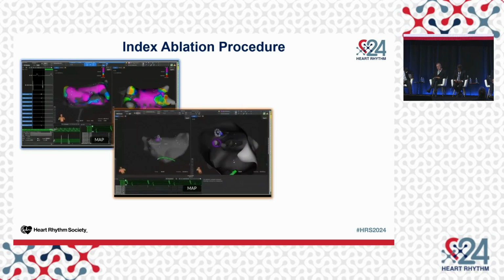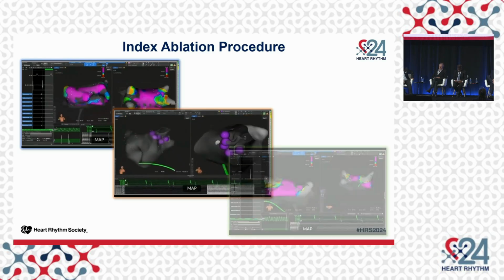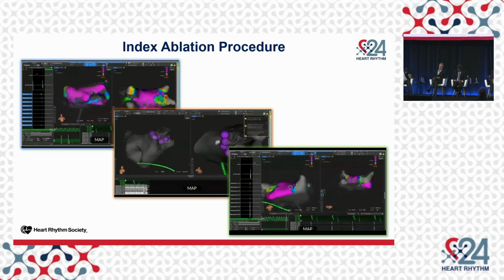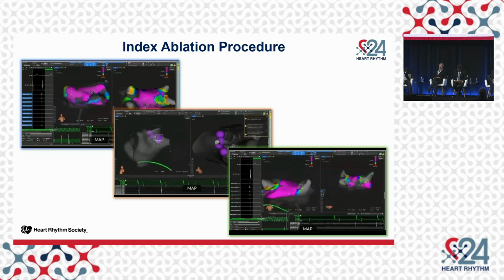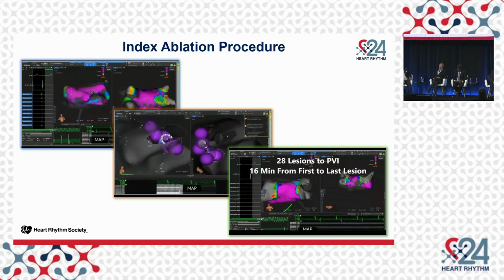Here you see the same catheter now after you've created the anatomy, making PFA lesions, and we're tagging them. And I think in the beginning we probably were a little bit lackadaisical about having the right distance and overlap, and we kind of learned that as we did more cases. And here you can see a remap using the same catheter after you've delivered these lesions.